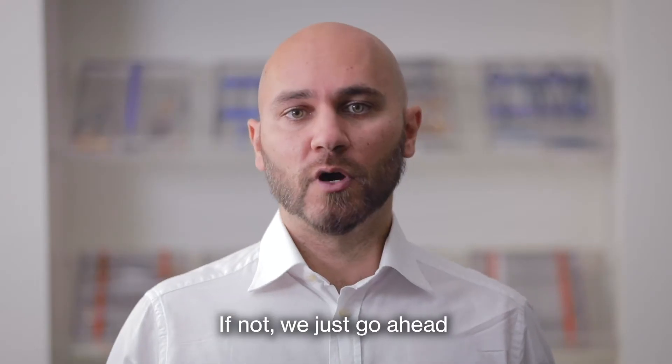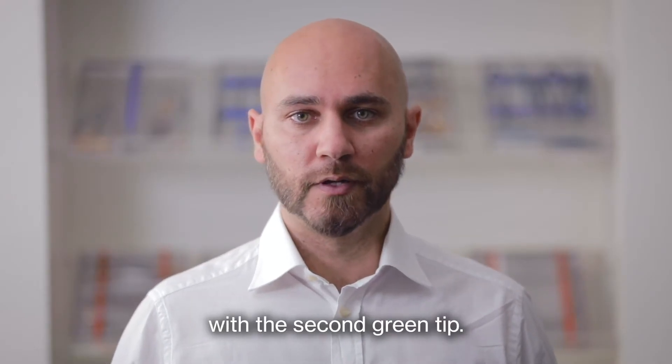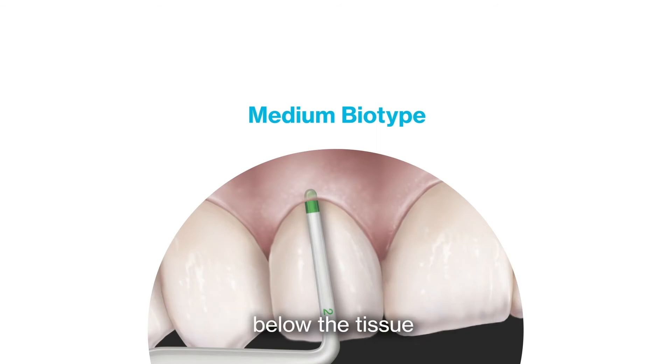If not, we just go ahead with the second green tip. If now we can see the green tip below the tissue, it means that we are in front of a medium biotype.